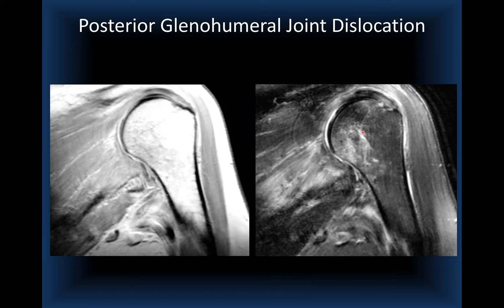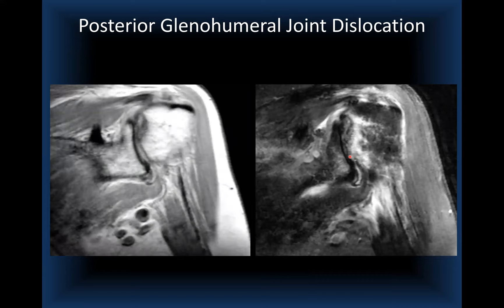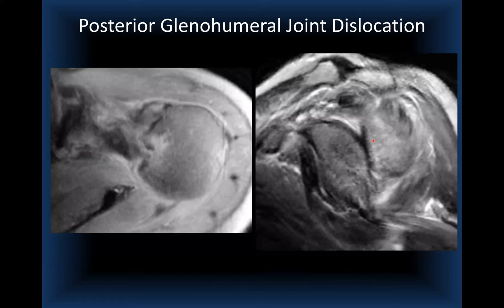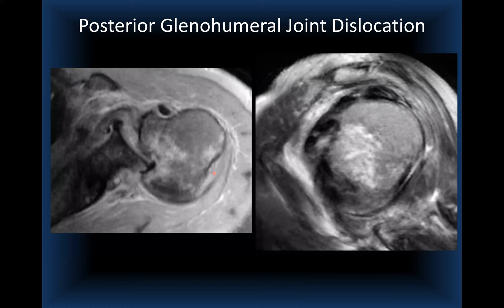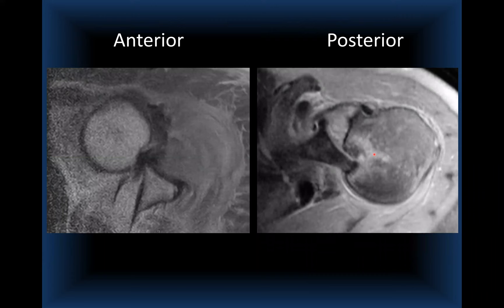As we scroll anteriorly, a small amount of biceps tendon is interposed, and the humeral head is not in its normal relationship with the glenoid fossa. On axial and coronal planes, the humeral head is perched or locked against the posterior margin of the glenoid, precluding normal concentric reduction. That illustrates both an acute anterior and an acute posterior dislocation imaged on MRI.